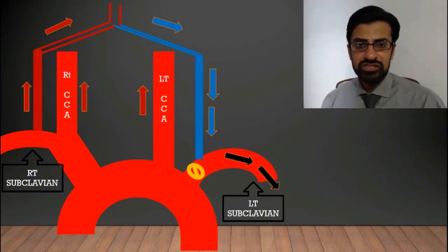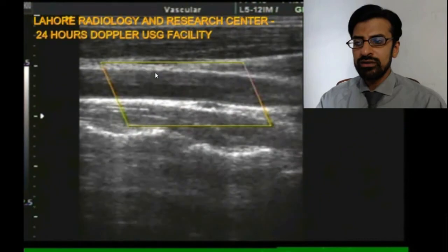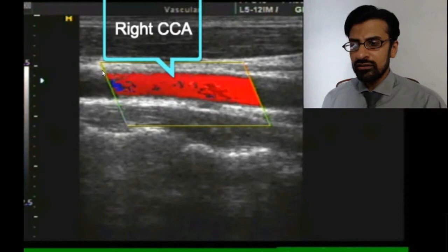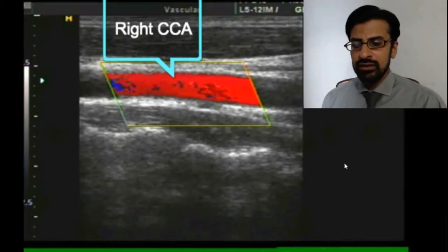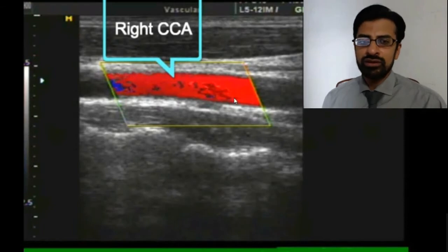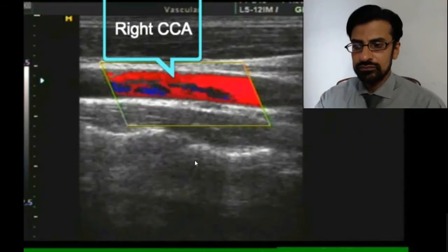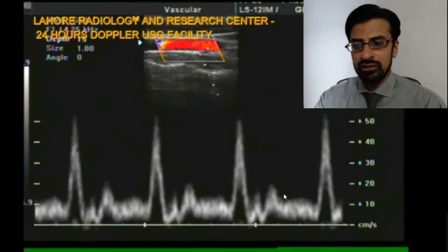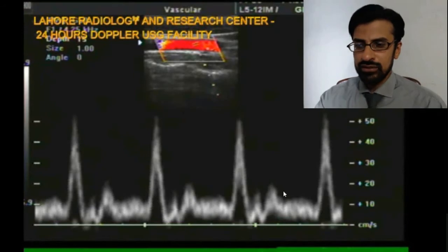Now let's see the Doppler study in this patient. This is the common carotid artery of the right side, running towards the brain. We have tilted the color box towards the heart; in these settings, the red color within the common carotid artery shows that blood is flowing from the heart towards the brain. When we applied pulse Doppler, it showed a normal waveform. The right-sided internal carotid and external carotid arteries were also normal with respect to color as well as the spectral Doppler pattern.